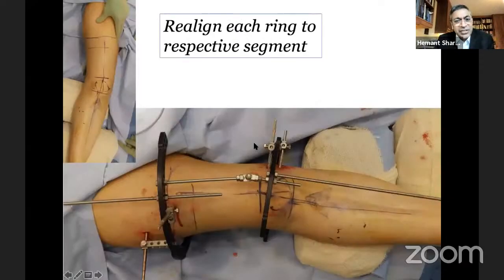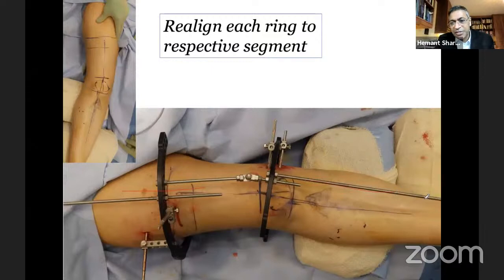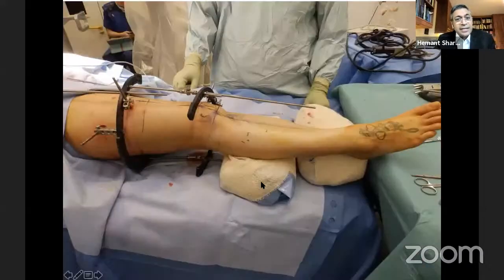This is an example of a hinge assisted, where these are long rods which are going to the center of the ankle. This is going to the piriform fossa, as the anatomical planning, and put your hinge where you want to do it. And then once you've aligned it, and we all draw lines like Mangal showed in his case, leave the space because it is a plating here. I've left the space for plating, and I'll show you another example later on as well for that.